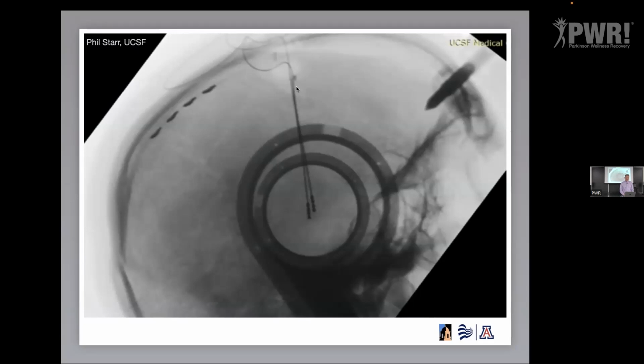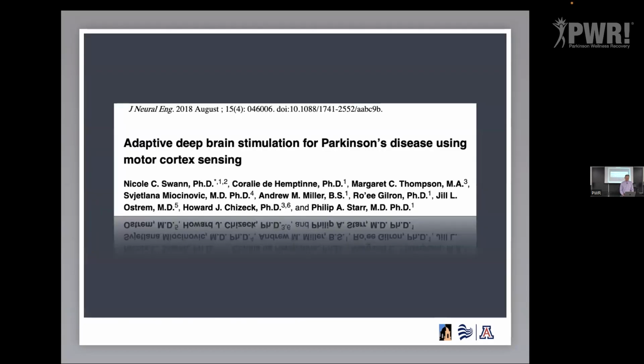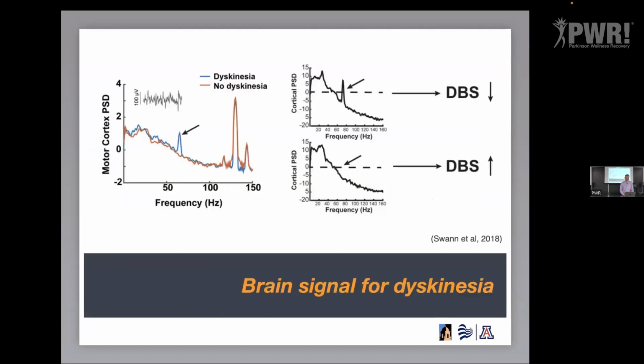This is an X-ray from the operating room. Phil's got two electrodes in the brain, but if you look up here, there's a little sensing electrode on the surface of the brain. This is over the part of the brain called motor cortex that's involved in our movement. What Phil showed is that you can detect signals based on symptoms. So this is just a little energy profile, a little brain activity profile of a single patient.